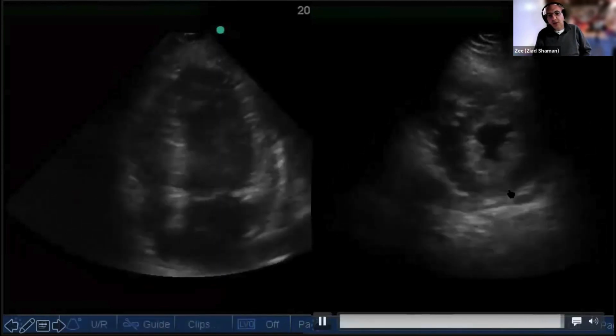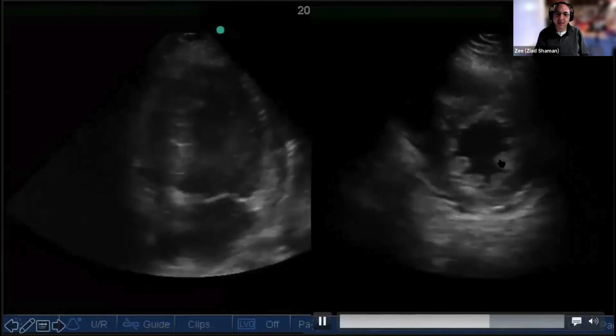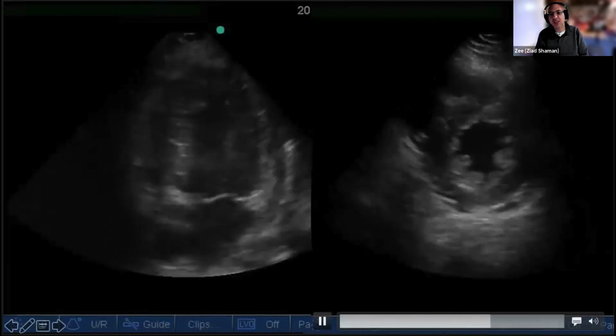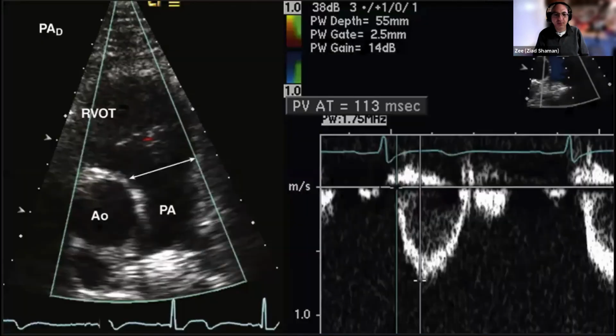And you eyeball the diameter against the septum diameter parallel to the septum, and you decide that the eccentricity index is 1, not abnormal. You look at the pulmonary artery diameter here, and you measure it to be, I have it here, 27 millimeters. So that gets you a point. You've got 1 point already.